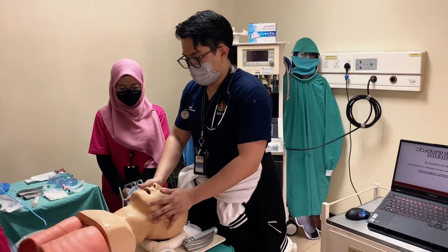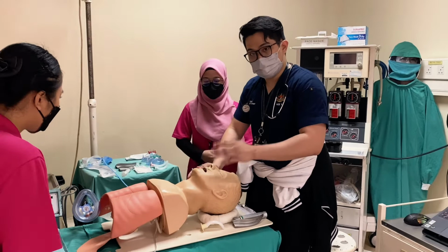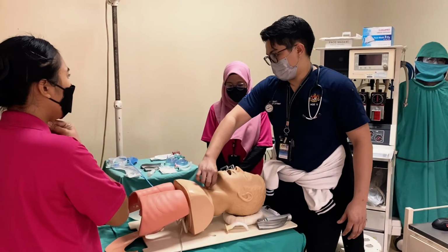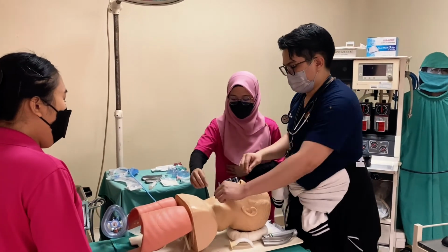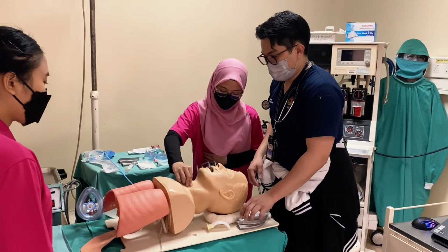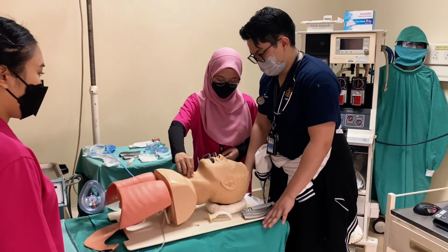And after the giving of the fasciculation, after the fasciculation ends at 45 to 60 seconds, it's crucial that one of your assistants maintain the cricoid pressure in that 45 to 60 seconds. We provide this cricoid pressure. Okay.